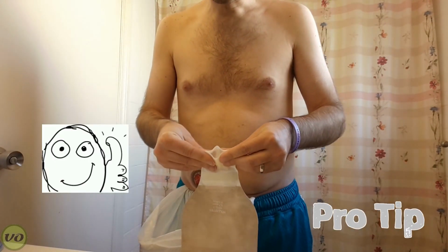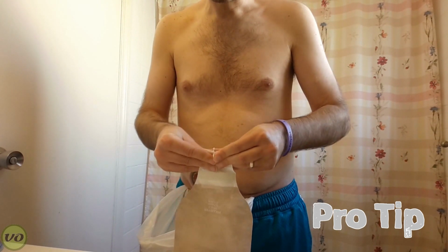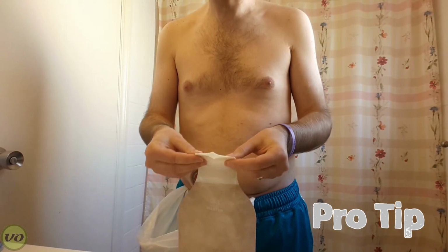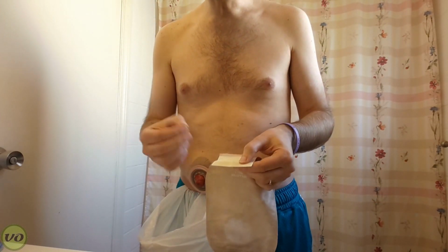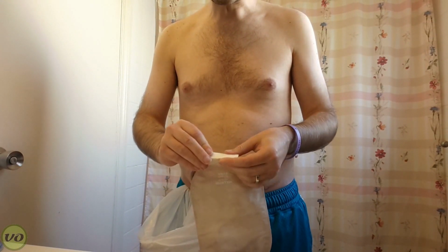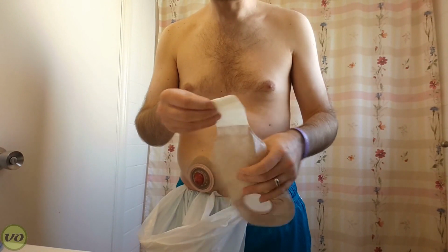So what I do here is I just crease the ends here, and that'll just allow the outlet to open up a lot easier the next time around, okay? You'll see I don't have to struggle with it. And you always want to make sure if you're using a drainable pouch to get everything all closed up here. You do want to get it on the right way. So you do want to make sure everything is closed. The last thing you want is to put on a new appliance and then have your output just go right out the bottom.